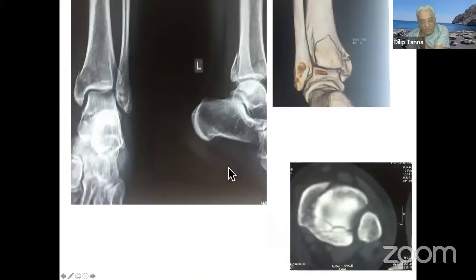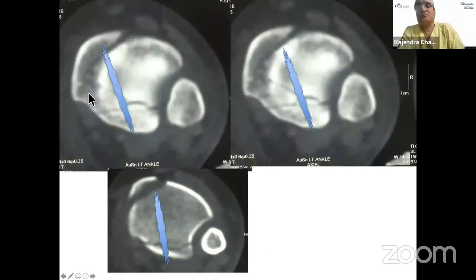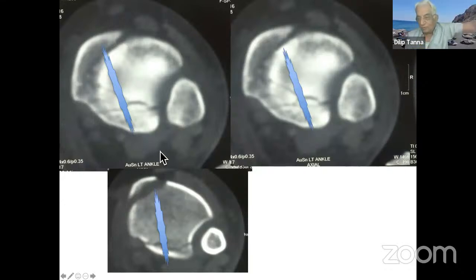So I treated it like normally, whatever was treated. I treated the posterior malleolus first. Having fixed the posterior malleolus, I went on and treated the medial malleolus. To me, the medial malleolus and posterior malleolus were 2 different fractures. First and foremost, my screw had already entered here, so I made that small. I made it small and I'm trying to put in the medial malleolus now.